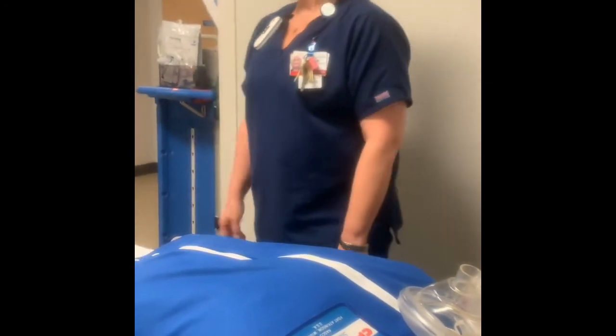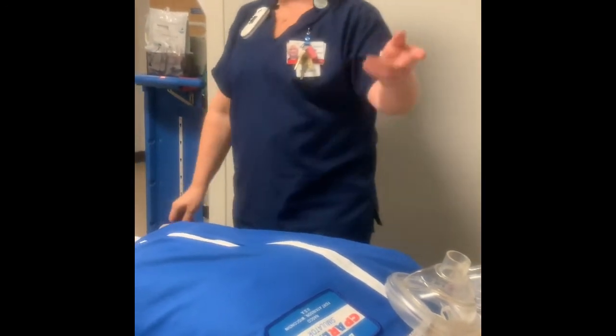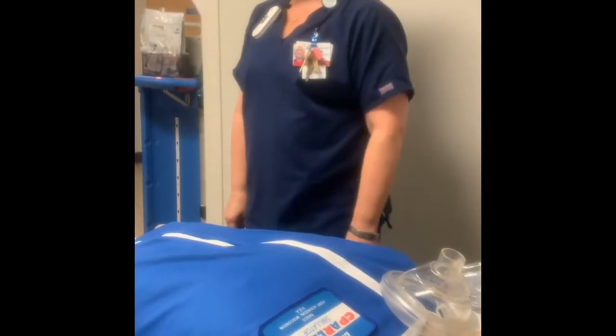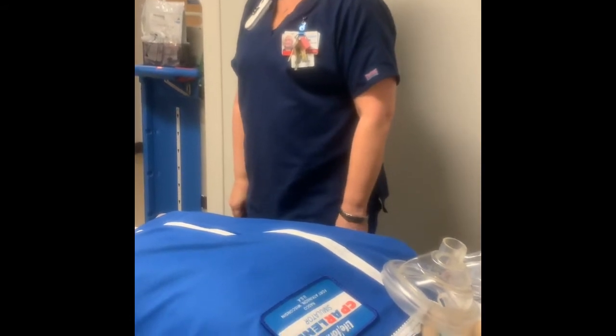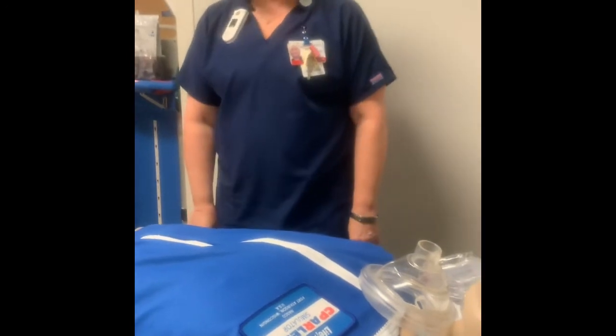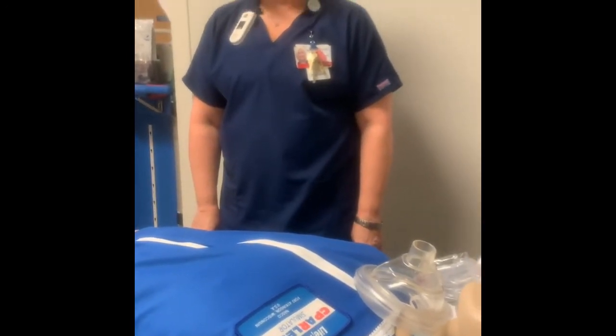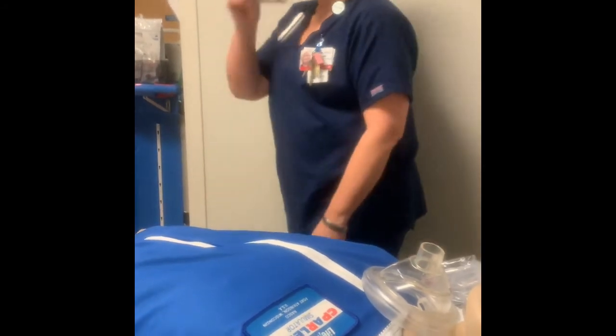So we don't do the patient any service though, like elevating their head or any of that in this scenario? Just leave them. If they're sat, fine. Just put an O2 sat on them so we can monitor that. Absolutely. Okay, and then one of us will come in and put the trach back in too, okay? All right, so go ahead.